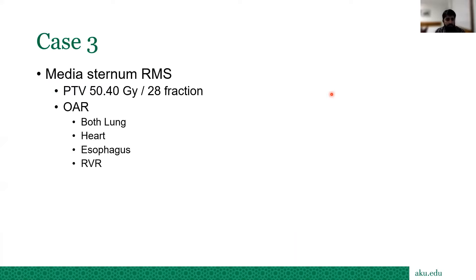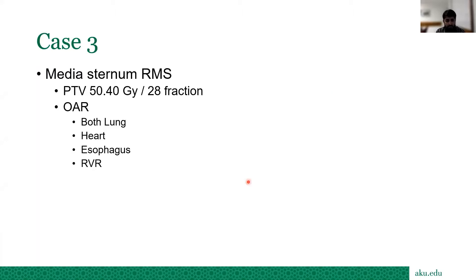Now for the third case — rhabdomyosarcoma. The PTV dose is 50.4 Gy in 28 fractions. The OARs are both lungs, heart, esophagus, and rest of volume. I would like to share my screen to show you this hands-on demonstration.